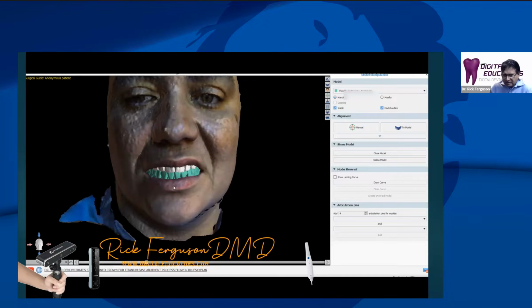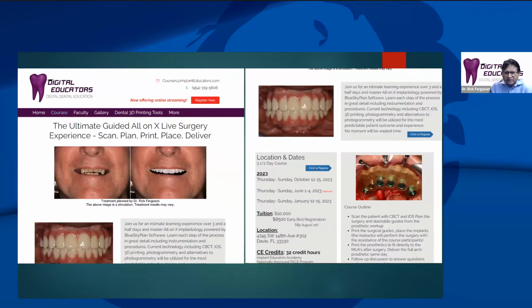All right. So out of all the work that we've done with Blue Sky Plan, All on X, designing guides, stackable guides, bringing in face scans, doing digital smile design, all of this gets somewhat confusing for folks, and it's a lot of things to put together. Some folks can go online and learn it all just from videos on YouTube. And again, thanks to Blue Sky for putting all this educational information out there.